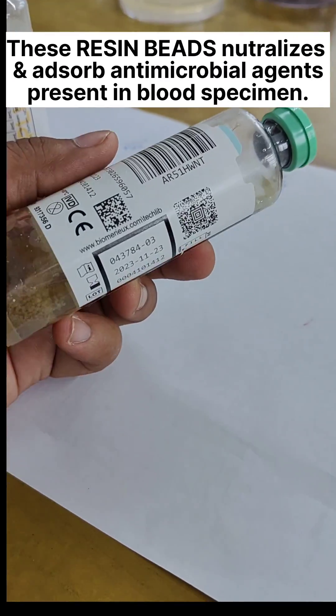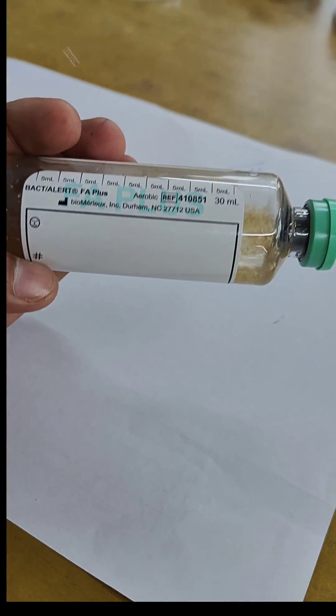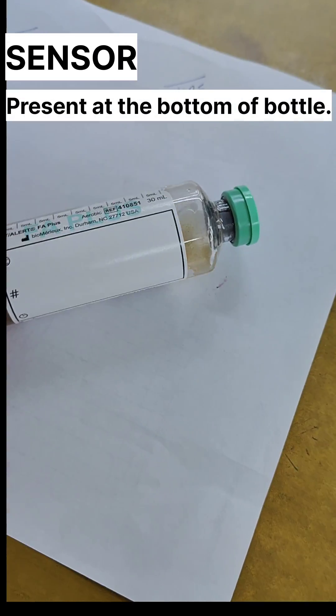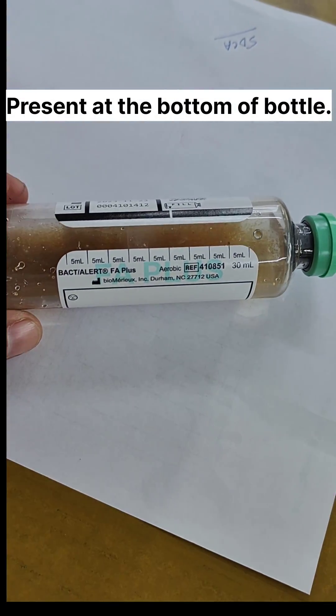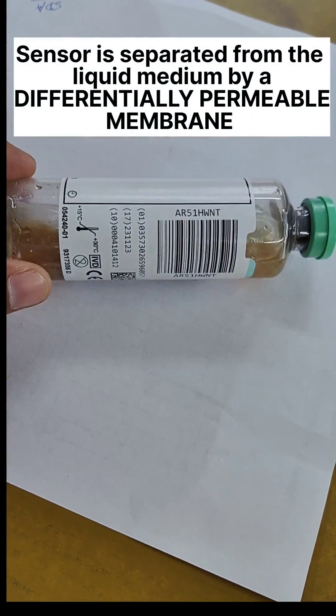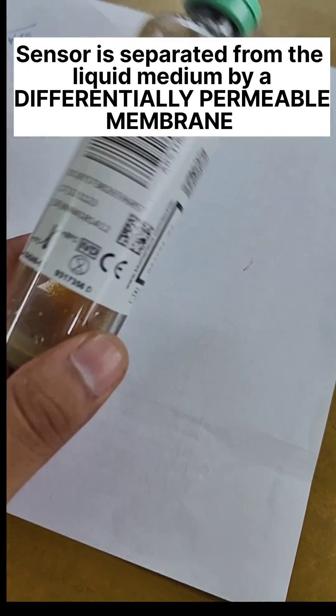You can easily see that a sensor is also present at the bottom of each bottle. This sensor is separated from the liquid medium by a differentially permeable membrane.